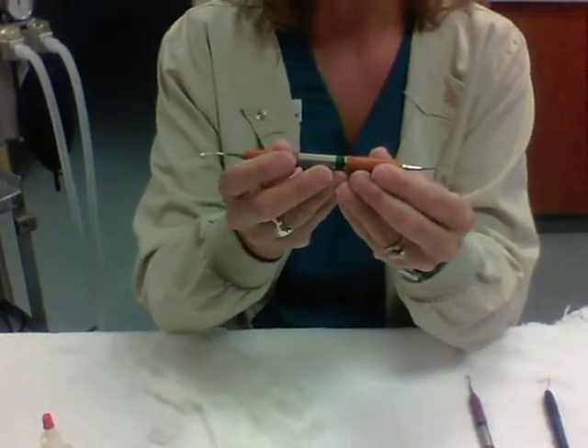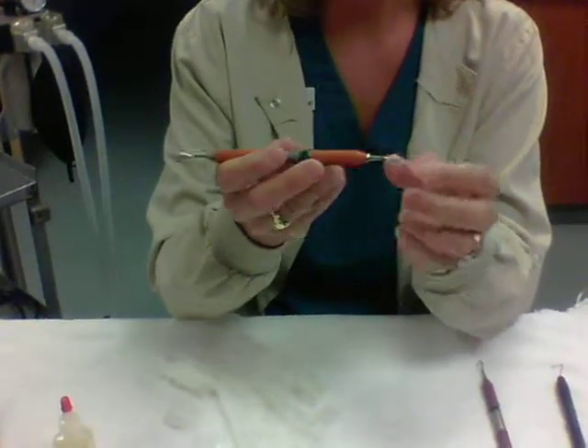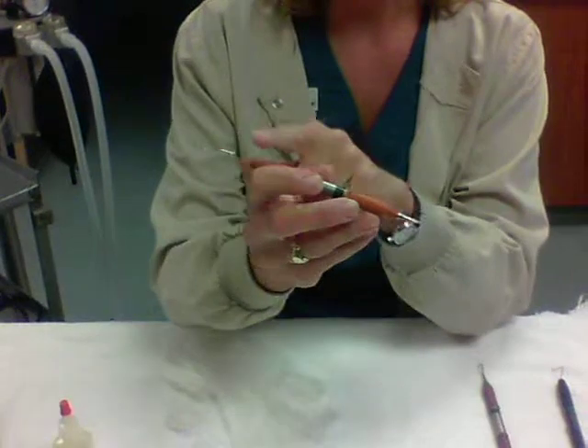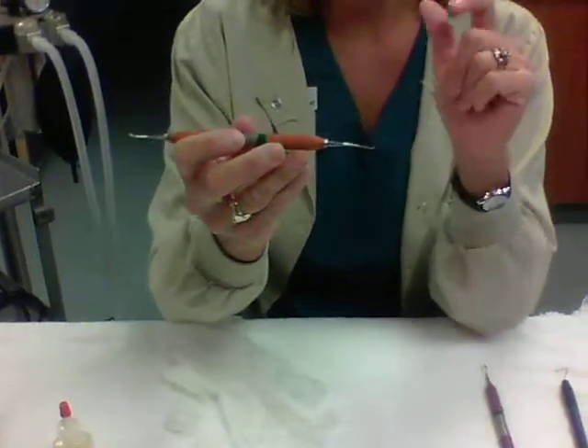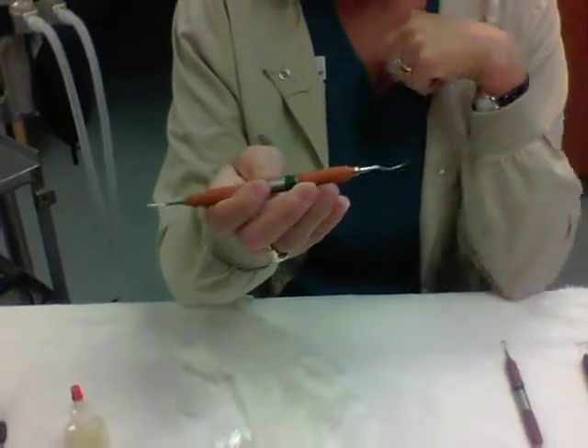Next, we have the curette, which is used for going under the gum line — subgingival. It has a little hook on either end, and it does have two edges to be sharpened as well as the tip, so we'll go through sharpening that as well.